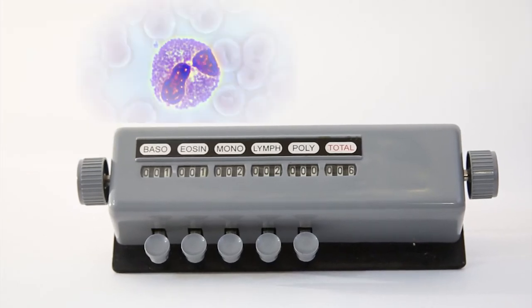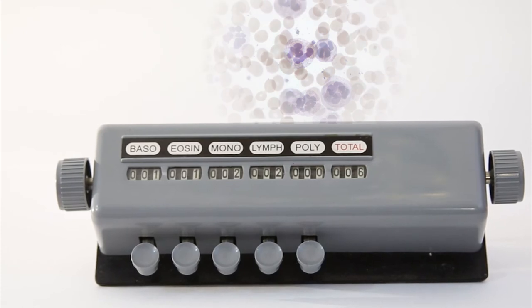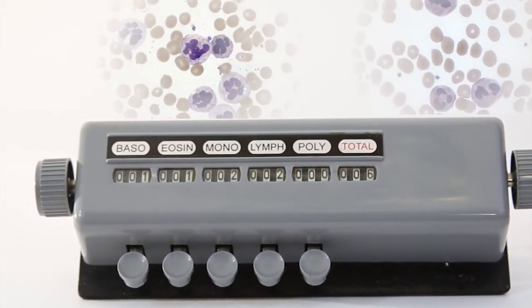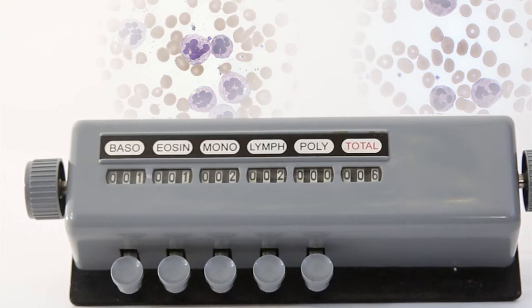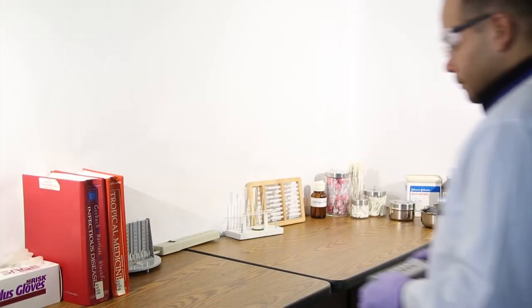Basophils, eosinophils, monocytes, lymphocytes, band neutrophils, and segmented neutrophils. The band and segmented neutrophils are counted together under the shared button of poly. Keep a mental note of how many bands make up the total.